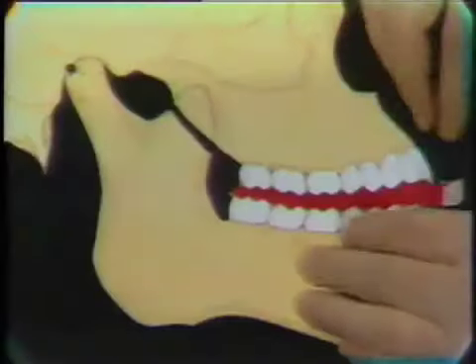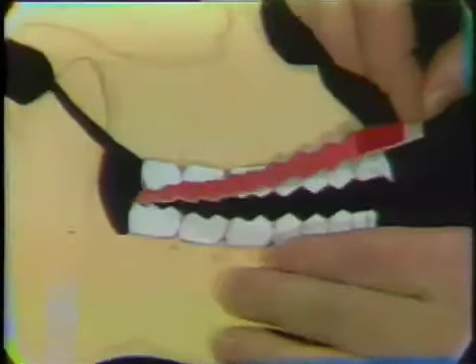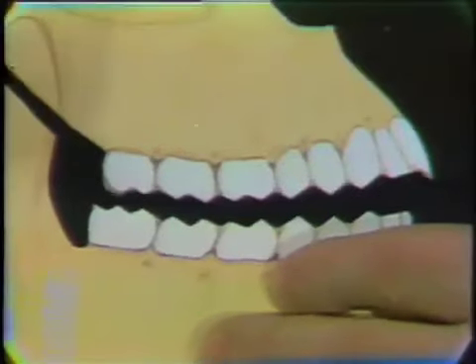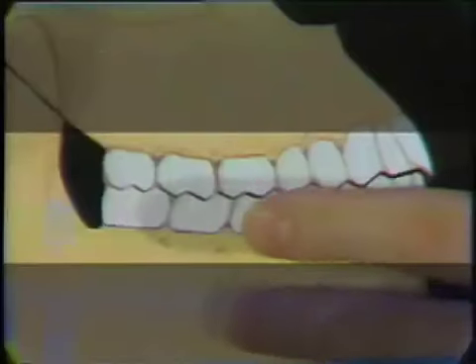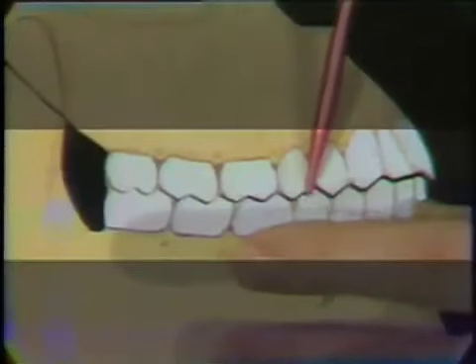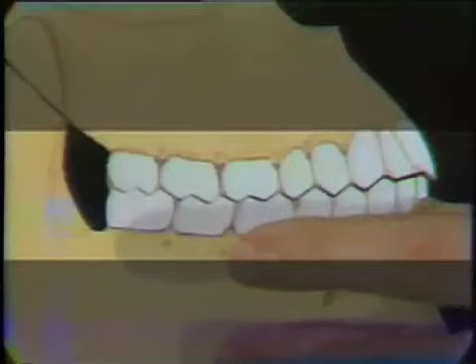Now this time, when we take the centric registration from between the teeth and we bring the teeth into contact, we see that we hit on these inclines rather than having the teeth come into an ideal contact relationship.